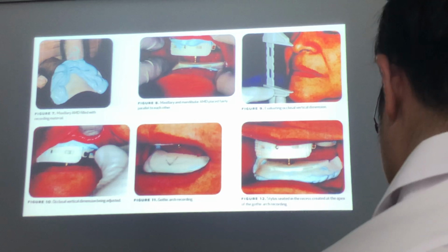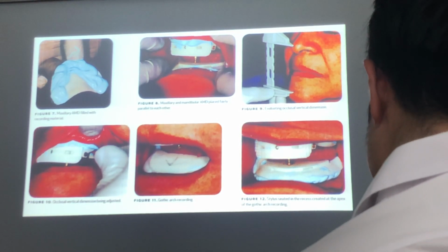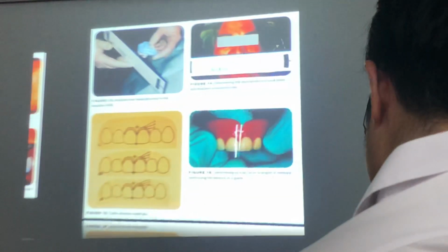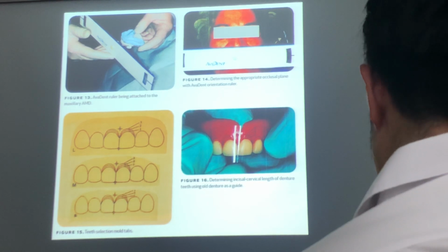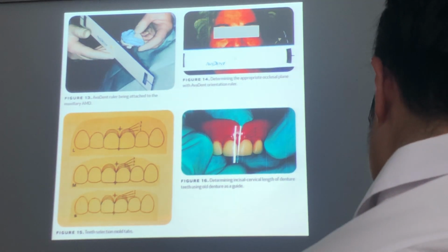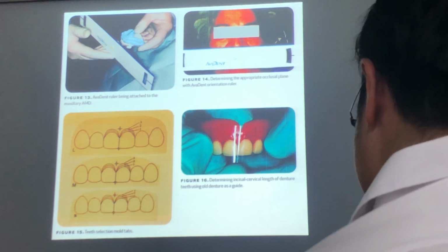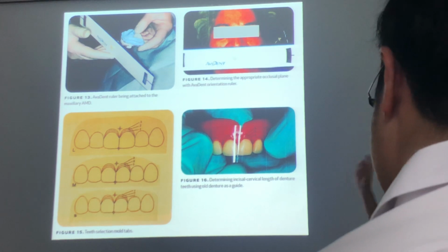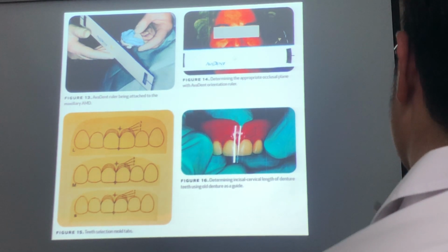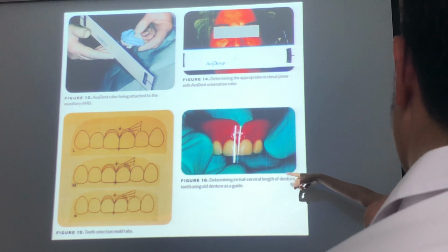If you are interested in CAD/CAM dentures, you can check out the website, maybe Avadent or Denga. There is lots of information on the website and also on YouTube. And this is how they get the plane. They sell you even a ruler. And they have the template, like a mould chart, made of plastic in many sizes, but it's not accurate.